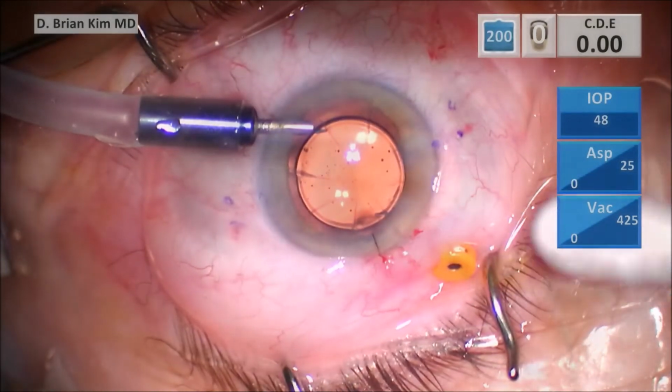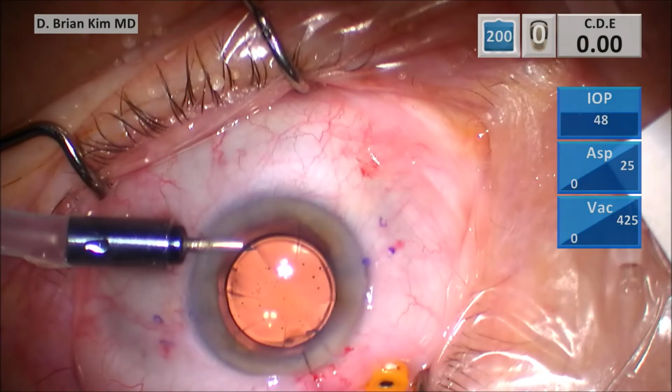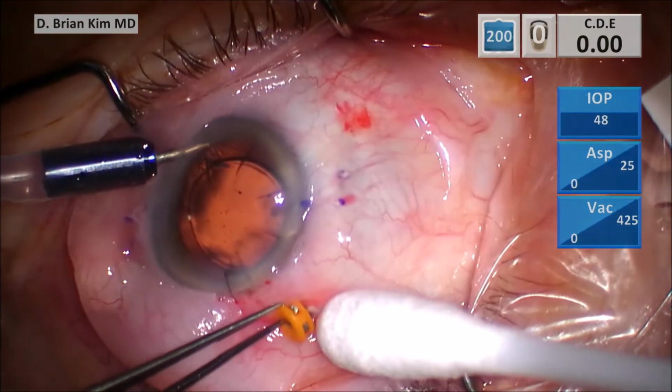Go ahead and grab the trocar. You can see first I'm checking my initial trocar site, and this is with infusion on. You can see it's nice and flat. There's no bleb of the conj over there.